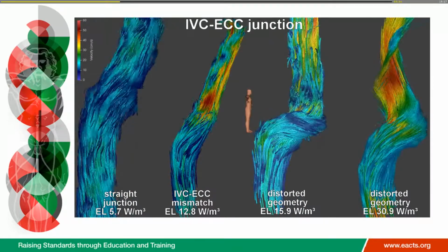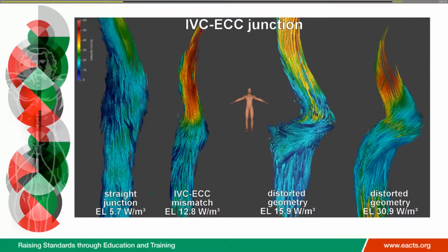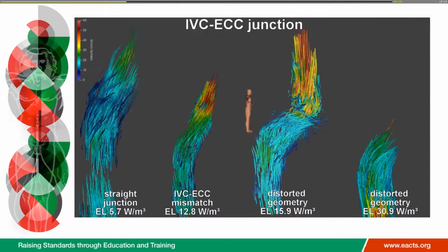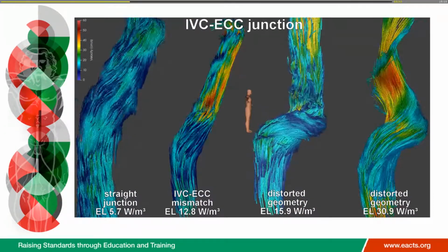Interesting. So some of your patients had a 16 millimeter conduit. So is that what you regard as being a mismatch, and would you not do that anymore? Yeah, so there was indeed, we had 7, so nearly half of patients had a 16 millimeter conduit.